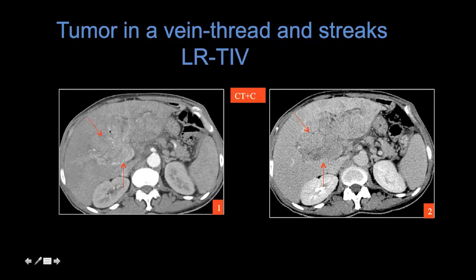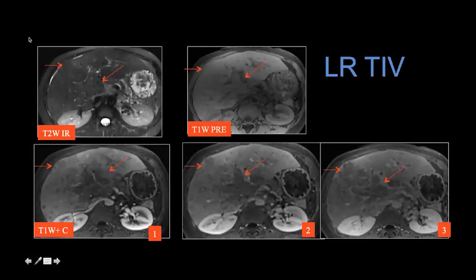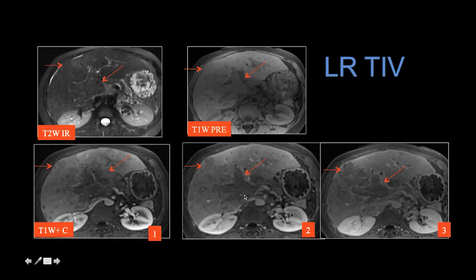Here we can see expansile soft tissue within the portal venous system. Unlike the rapid flow in other vessels that appears dark on T2, here we see gray on T2. Notice the expansion on T1 and the stippled threads-and-streaks appearance throughout arterial and portal venous phase images in this patient with infiltrative malignancy. This CT example shows a beautiful case of large expansile tumor thrombus throughout the portal venous system with neovascularity. Tumor in vein with infiltrative disease is often very hypovascular, so we need to put it together with all of the other features.